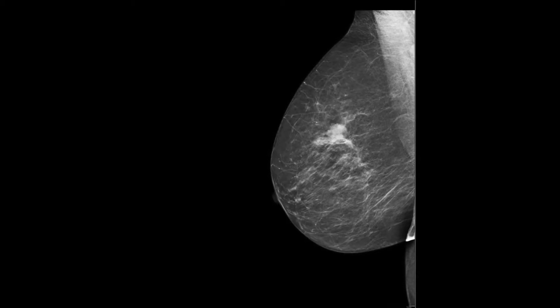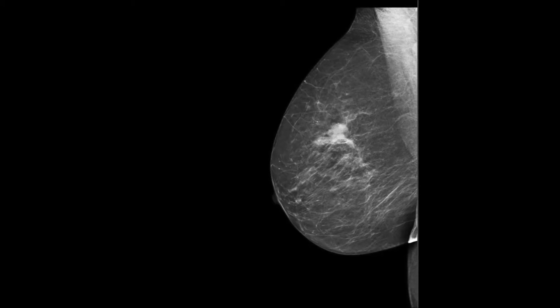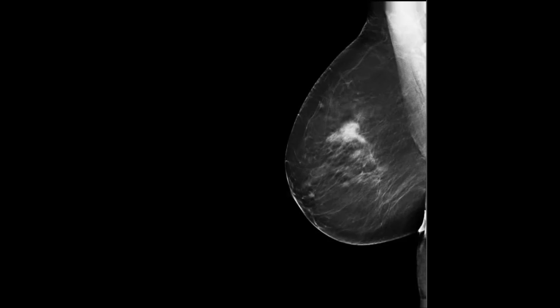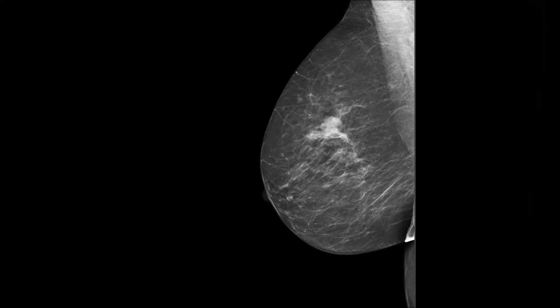On a typical volume preview image, you have what looks like a 2D mammogram — they take the 3D data and sum together all of the information to make an image that looks a lot like a 2D mammogram. Sometimes you can't really tell the difference between a synthetic volume preview image and a 2D mammogram. In fact, the latest software version of the volume preview algorithm, which I'm looking at right now, I would not be able to tell this wasn't a traditional 2D mammogram.